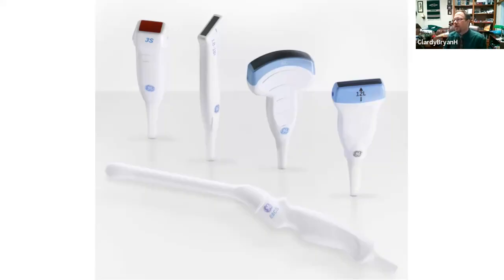You'll see there's that linear probe, that L8 to 18. That's a tunable probe that will do multiple frequencies right there. So that's a pretty versatile probe there. Next slide.